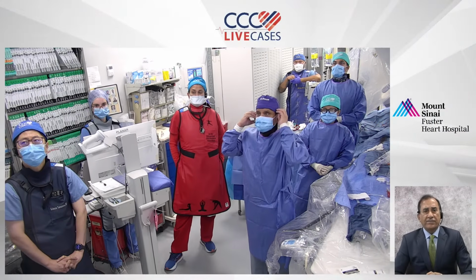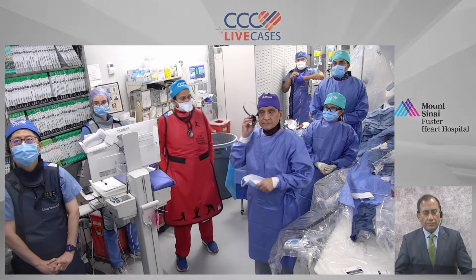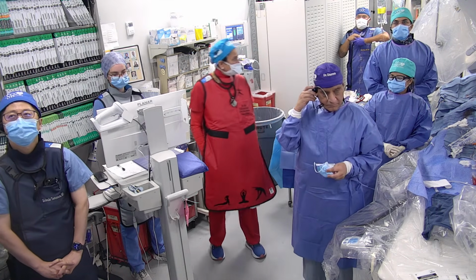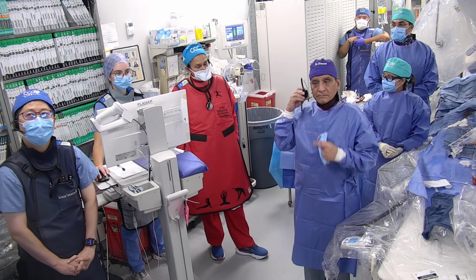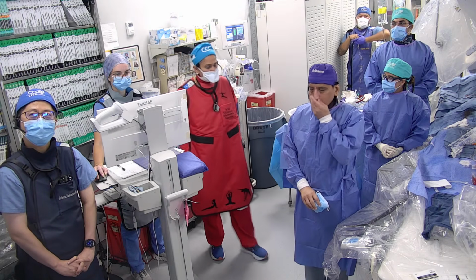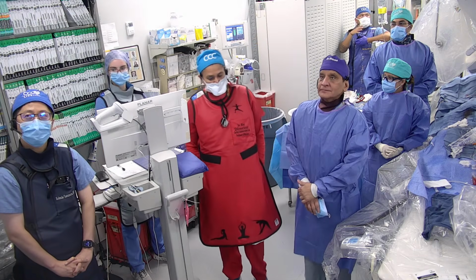Wonderful. Anu, any final comments from you? No, I think we went through all the steps, especially when to use imaging and when to do PCI without imaging. A lot of importance is being paid to imaging, but it is important for people to learn also how to do PCI without imaging, using their eyes, E-Y-E. Yeah.